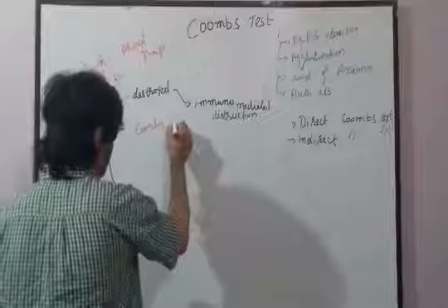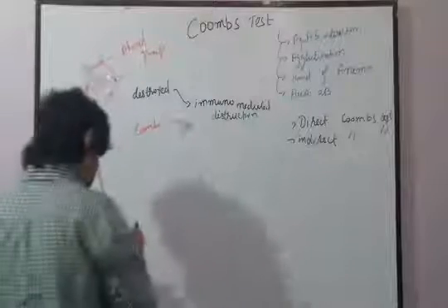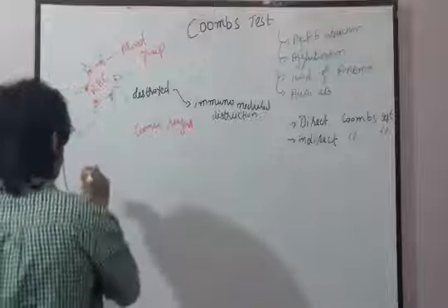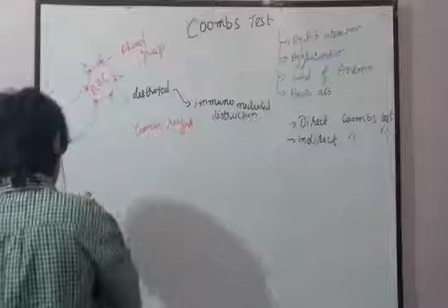What is Coombs reagent and how can we prepare it? Let's suppose first of all we take the blood sample from the patient.